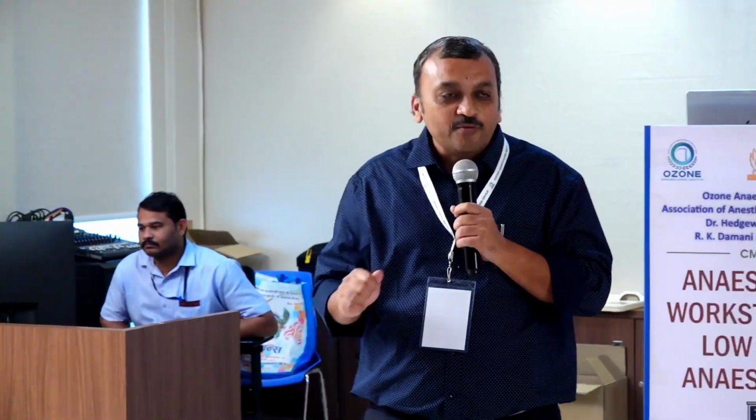Secondly, as sir said, this has been the traditional teaching for us. 1:2, 500 ml ka tidal volume, 2+2, 4 liter ka flow rate, and this is what we have been doing. So over a period of time, we need to change our thought. It has to be an individualized ventilator setting. For example, you get a patient, exploratory laparotomy, perforation ke saath mein hai, acidosis hai, and he's trying to compensate his metabolic acidosis by hyperventilation. You intubated the patient, and now you have kept a respiratory rate of 12.